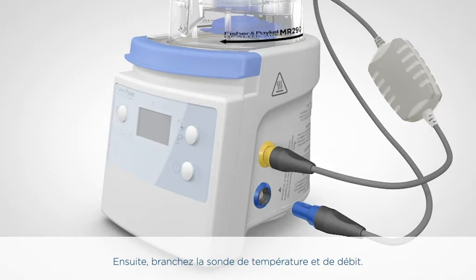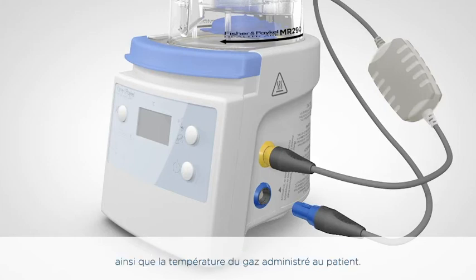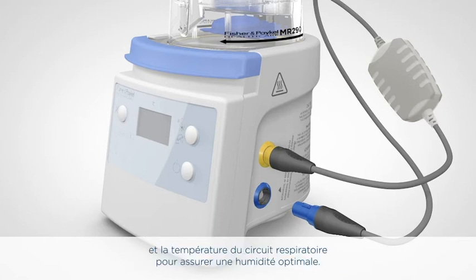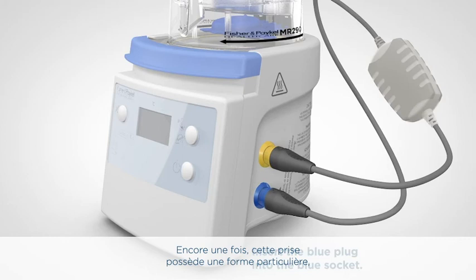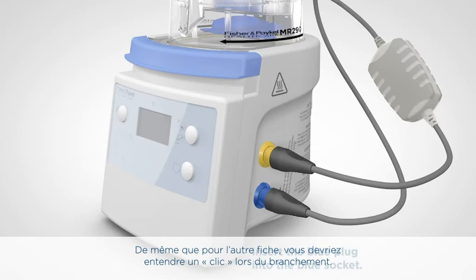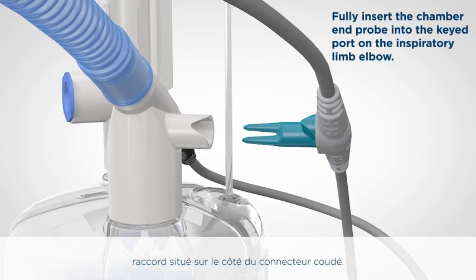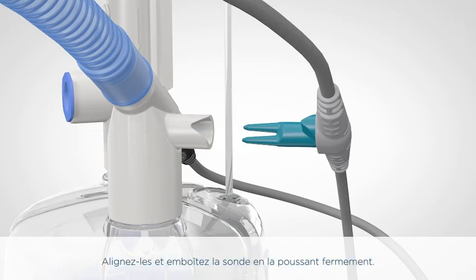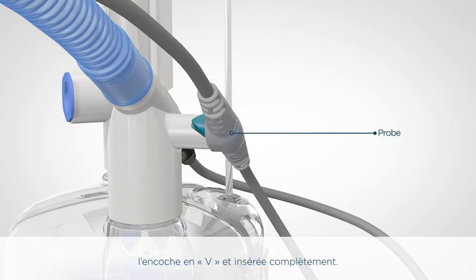Next, let's connect the temperature and flow probe. This adapter has a blue plug and is used to measure the temperature and flow of gas at the chamber and temperature of gas delivered to the patient. This information helps the humidifier control the chamber output temperature and the breathing circuit temperature to ensure optimal humidity delivery. Connect the blue plug to the blue socket — again, this socket is keyed, so you may have to turn the plug to insert it. Connect the temperature and flow probe to the port in the side of the elbow connector. The probe port includes a V-shaped notch corresponding to a V-shape on the probe — line these up and push the probe firmly into place. Infant circuits use a friction fit. It is important for correct operation of the humidification system that the probe is lined up with the V-notch and inserted fully.